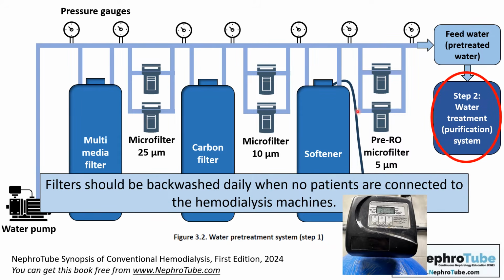Before going to step 2, I want to mention another point regarding the pressure differences between the pressure monitors before and after each tank. When you install the tank and it is working properly and the water is meeting the standard quality that I will mention later, at this time you will know the baseline pressures before and after the tank. This will be the baseline and the standard of this tank.